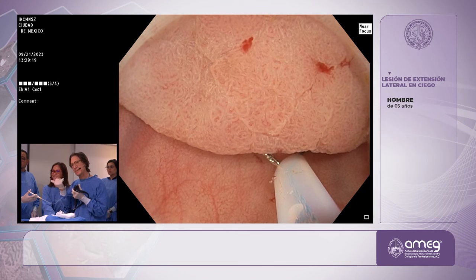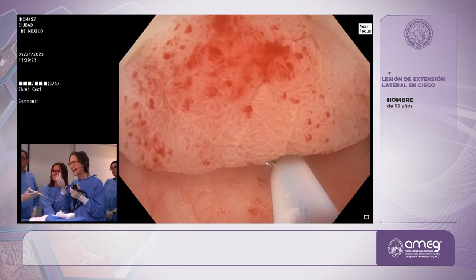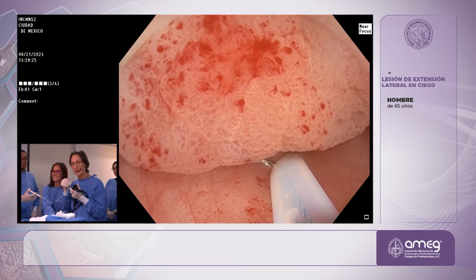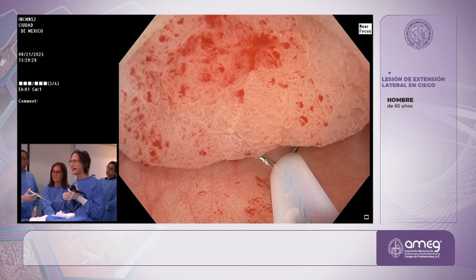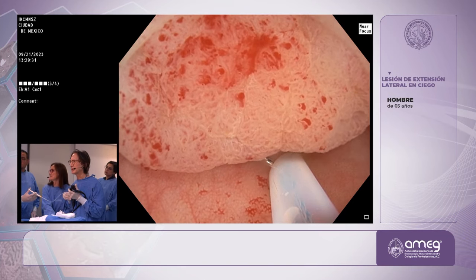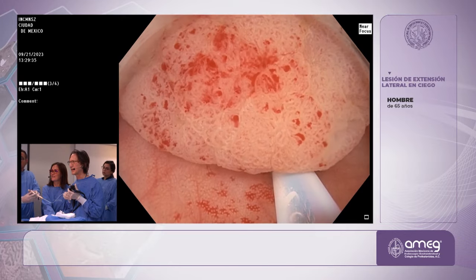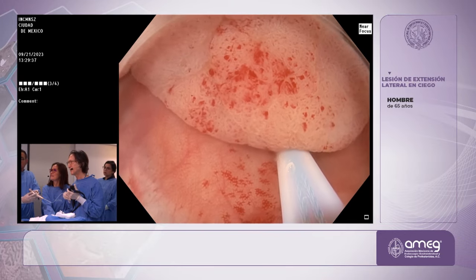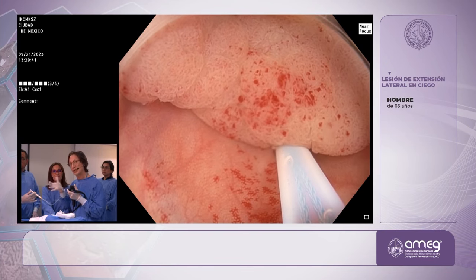But you see it coming in? So I really want to get it, oh, there. Now, when it goes all the way in like that, I stop and then give some water because I don't want it to white out on me or red out on me. Start to close, please. Close, close, close. And wait till it's snug. Is it snug? Yeah. All right, so my nurses know when to hold it.